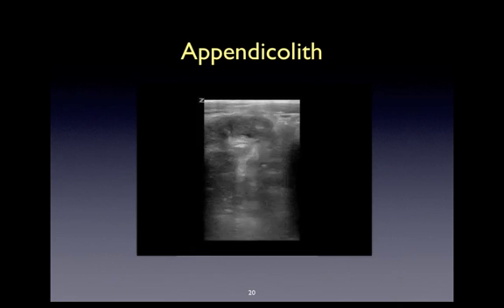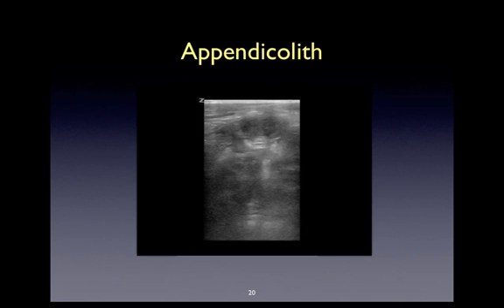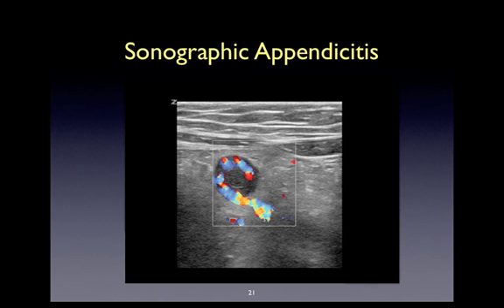Here in this clip, we can appreciate that what pops out before even appreciating the structure of the appendix is the presence of an appendicolith. In this example of appendicitis, there is a targetoid structure in the right lower quadrant. The sonographer applied color flow Doppler, and you can appreciate that in addition to having a mean outer diameter clearly greater than 6 mm, there's also a lot of hyperemia to this wall, which you can confirm by putting Doppler onto your image.